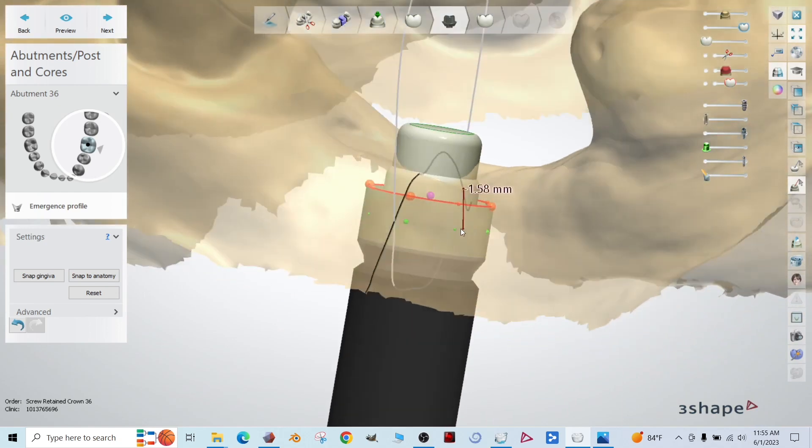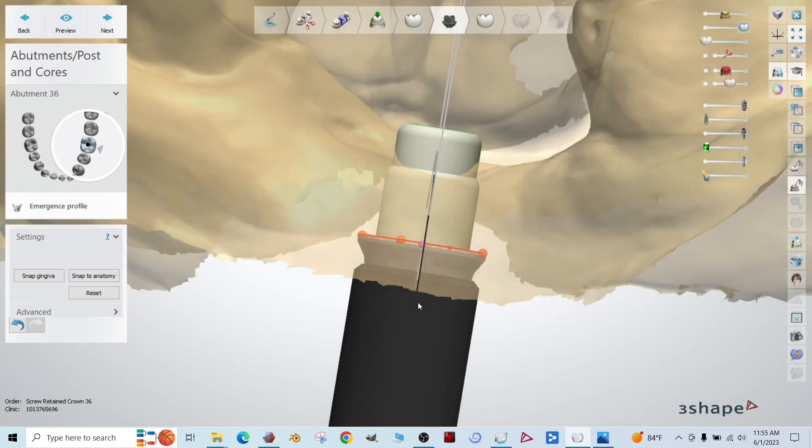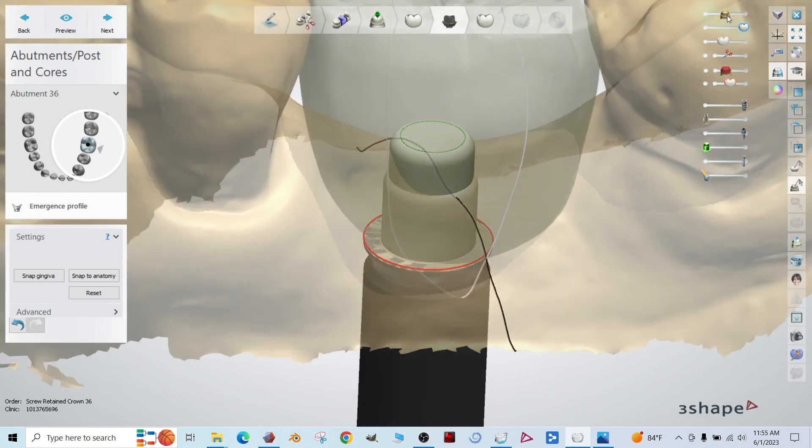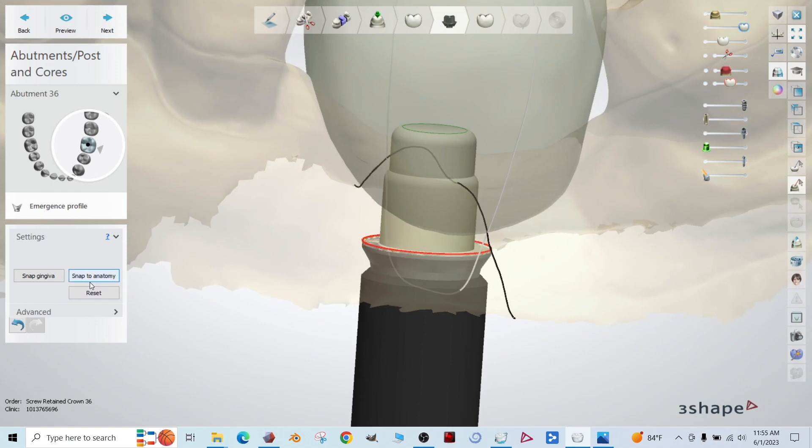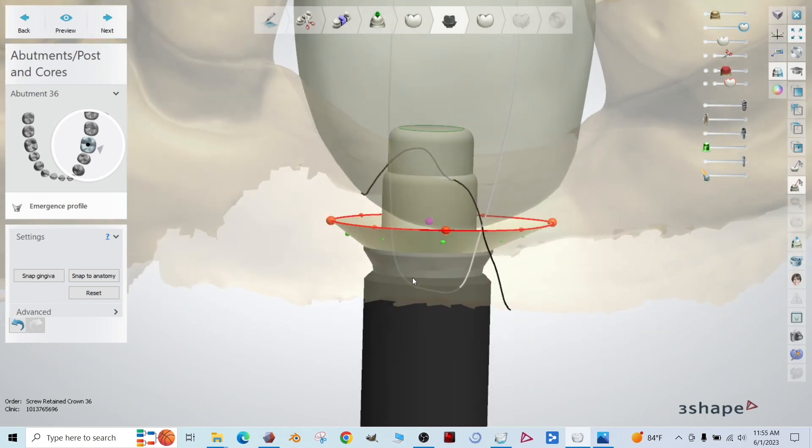Okay. Now we're going to grab this purple dot in the center. We're going to drag this all the way down to the collar. Perfect. And then if we turn on our crown a little bit here, off to the left, there's a snap to anatomy button. Click that. Okay. We've snapped the anatomy. Sometimes you need to click it a couple of times.